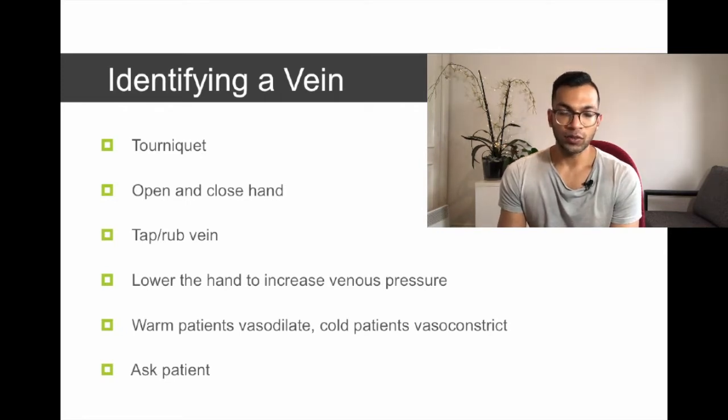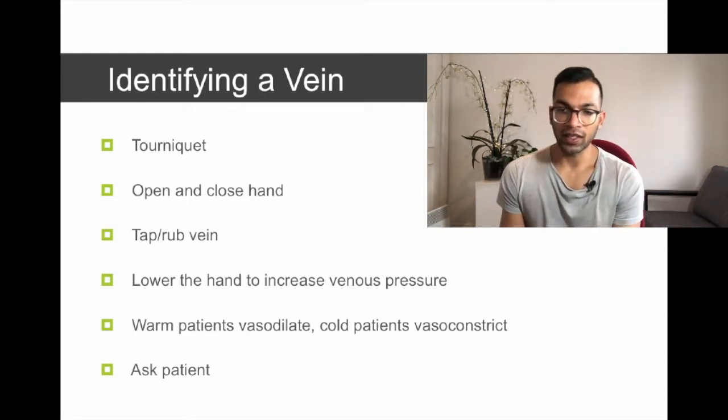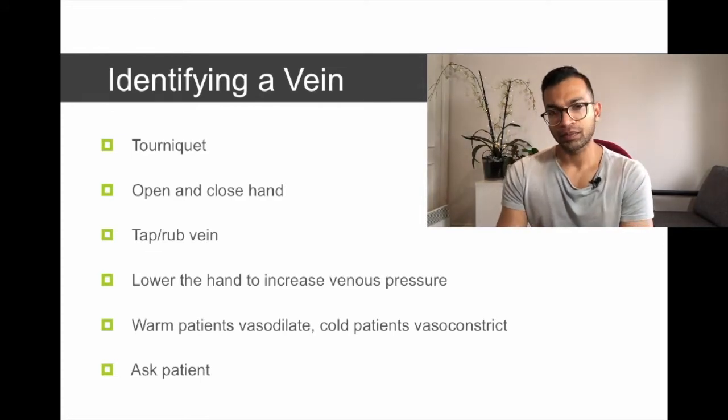And one of the things that has worked really well for me in the past is just to ask the patient, where is your best vein, and where have people found vascular access previously, and then go for that.